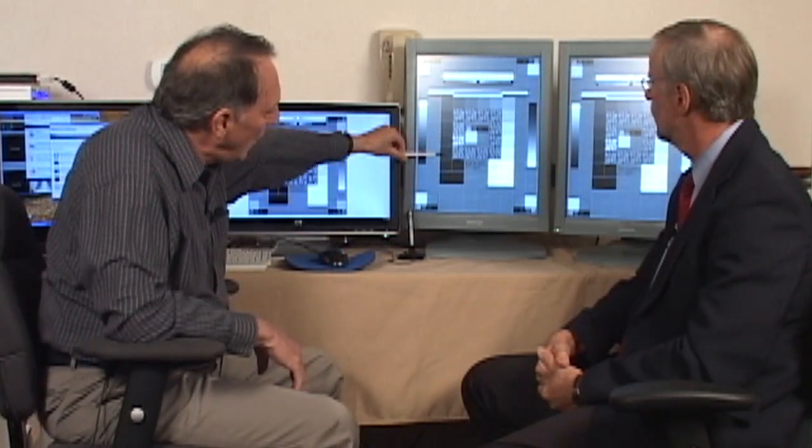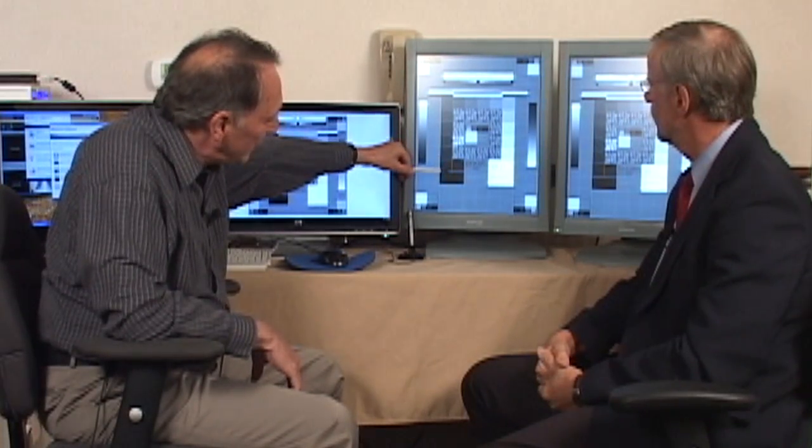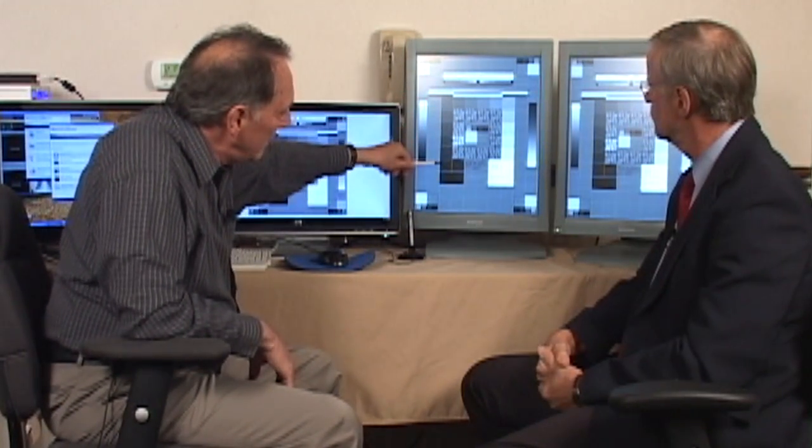And when you have a much brighter display, a lot of times your eye is adapting to an average luminance. So sometimes as you get into the darker ones, it's extremely difficult to see the squares, low contrast targets in the corners down here. Generally speaking, if you can see the majority of these all the way around on a medical grade display, you've got an excellently calibrated display. The luminance is very well distributed throughout the whole range of the display.